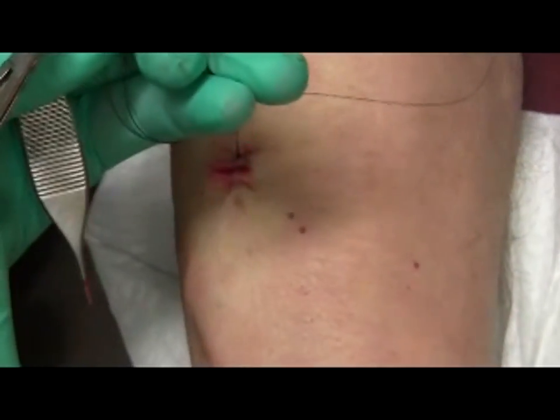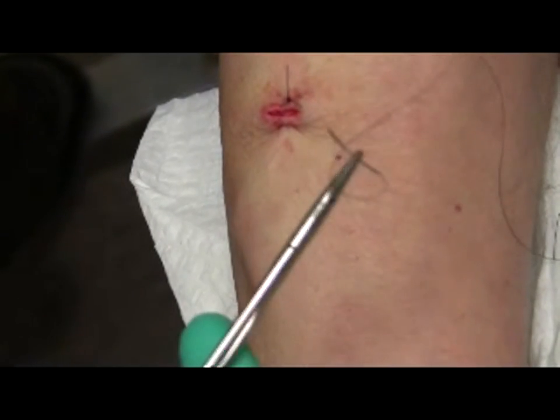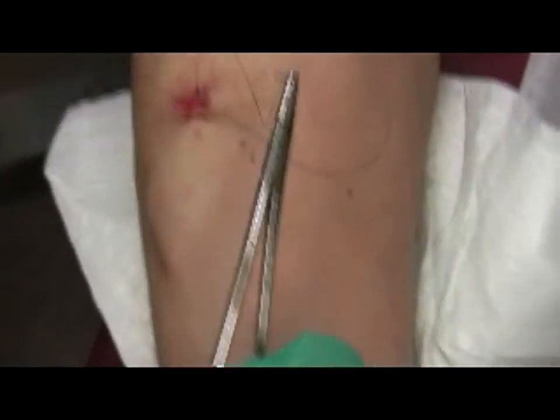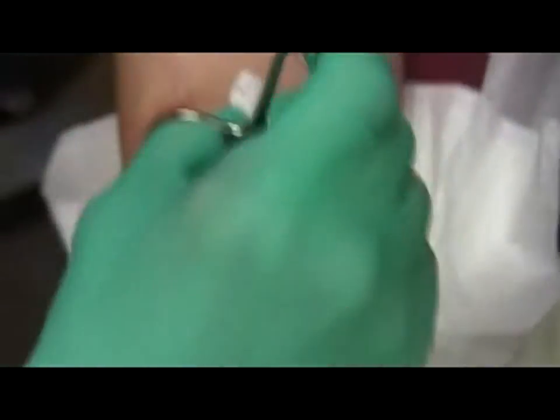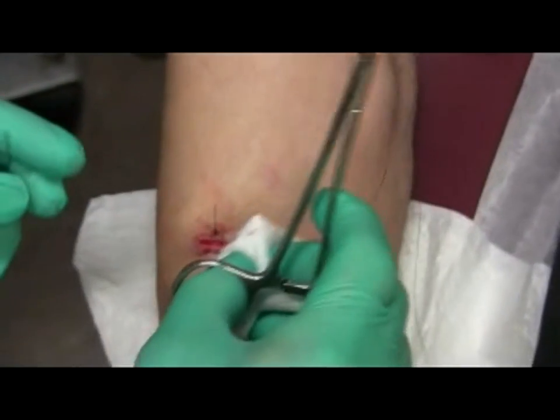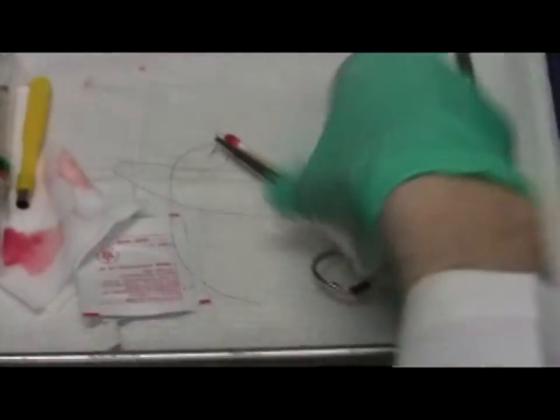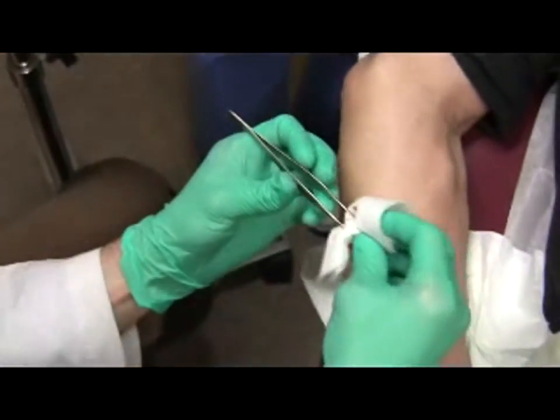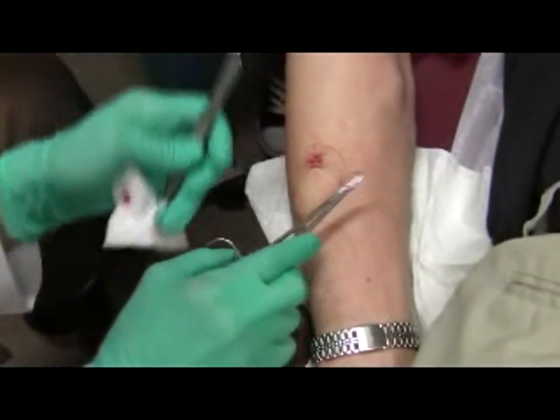Reload the needle driver. At this point, bleeding may still be brisk and you are holding a loaded needle driver. Fight the instinct to blot at this point — rather, first put down the loaded needle driver, then make a motion to blot. If you try to hold gauze and blot with the same hand holding the needle driver, you can stick your other hand. If you don't have an assistant, put it down, grab the gauze, and blot. Alternatively, use the gauze in the forceps and then blot.